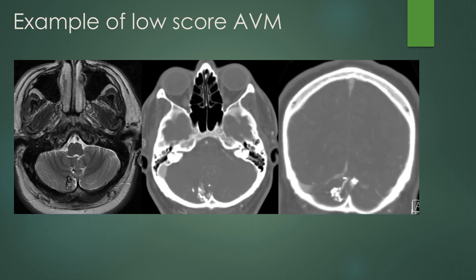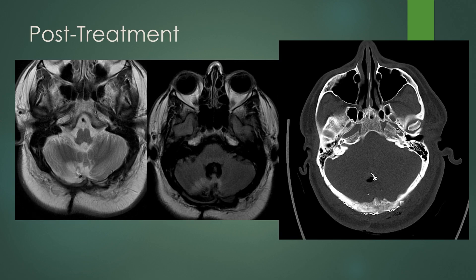This is an example of a low-score AVM. Here is the nidus in a cerebellar hemisphere. It measures less than 3 centimeters in maximum diameter and is draining into a cortical vein before reaching the torcular. This would be an AVM that could potentially be operated upon, and in this case it was. You can see the craniotomy defect in the occipital bone, some encephalomalacia in the right cerebellar hemisphere and vermis, the clip used for the arterial supply, and a little post-surgical air from the craniotomy site.